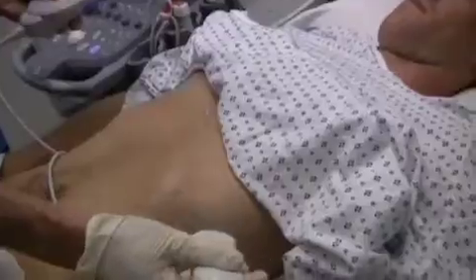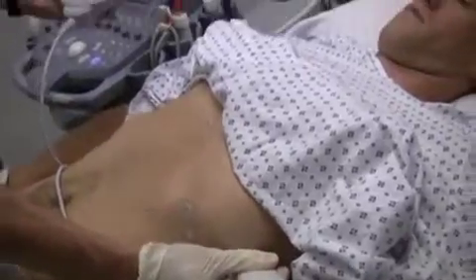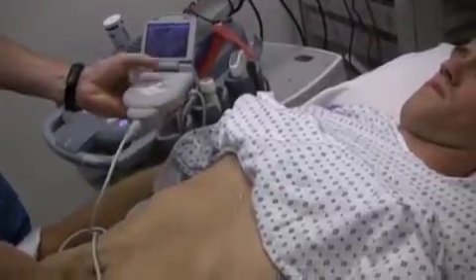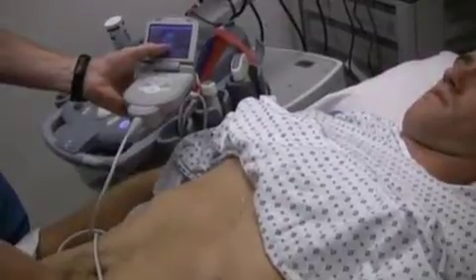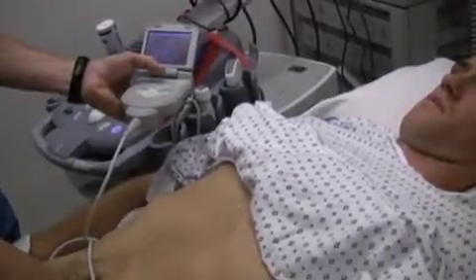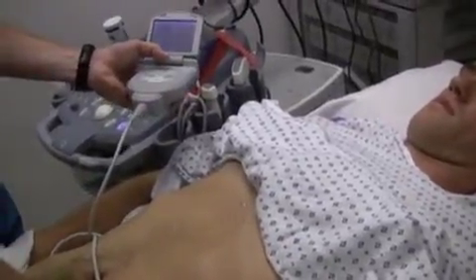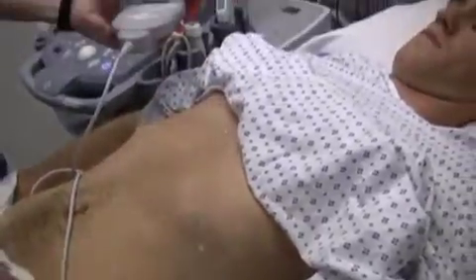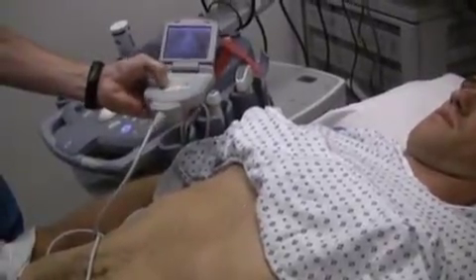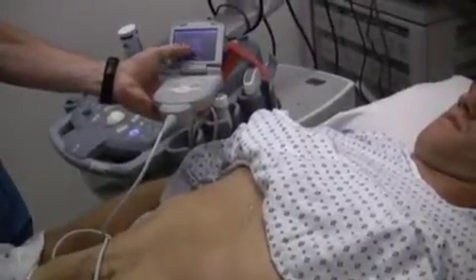Going to the left upper quadrant, our probe is parallel with the patient's ribs. We can see the diaphragm very nicely here with the spleen below it — the white line of the diaphragm. We need to decrease the gain a little bit. We can see the splenorenal space — just the hint of the top of the kidney. The bowel gas that's been impeding us is resolving a little bit, and we can probably say there's no splenorenal fluid. When we go down a couple of rib spaces, we can see the inferior pole of the kidney with the psoas right behind it. The inferior pole is moving up and down with respirations, and there's no free fluid around it.